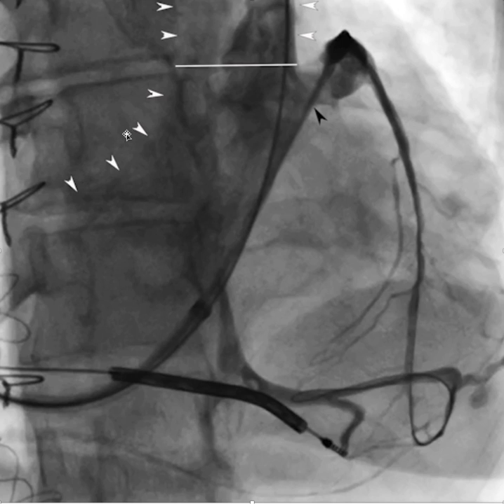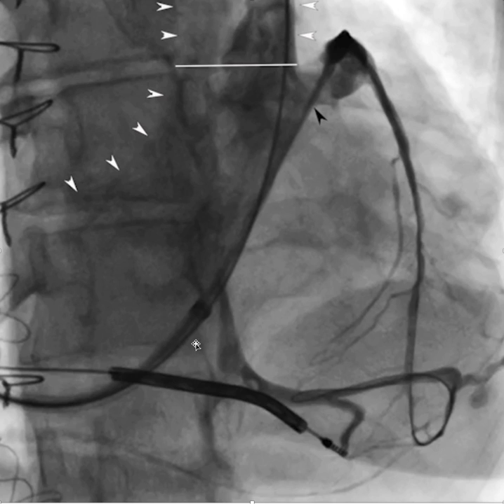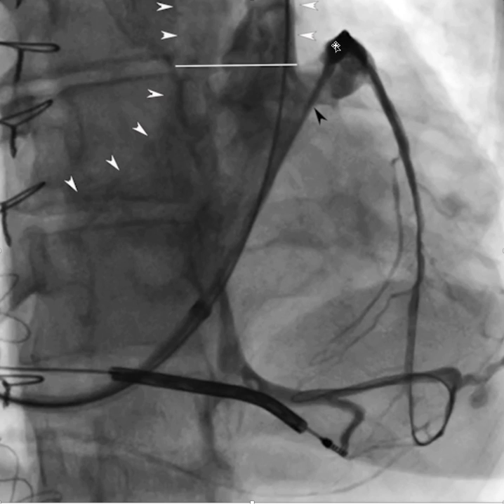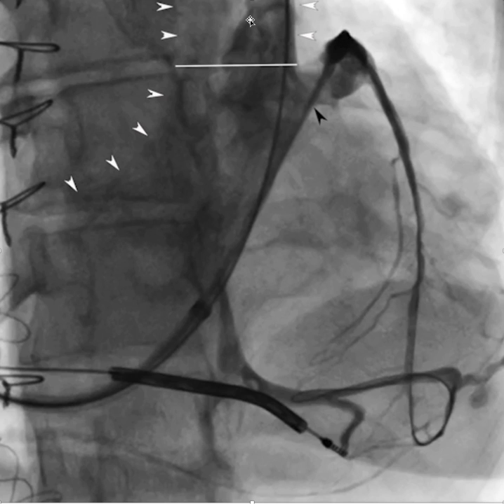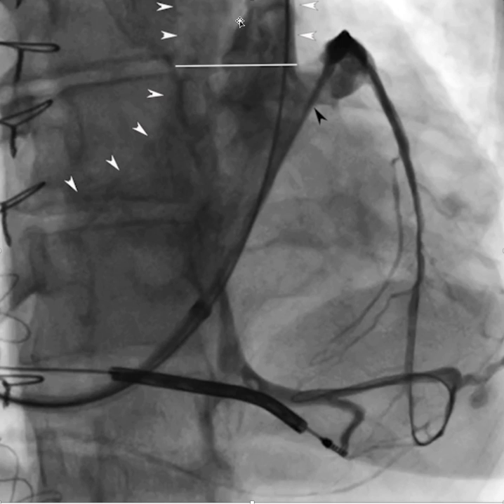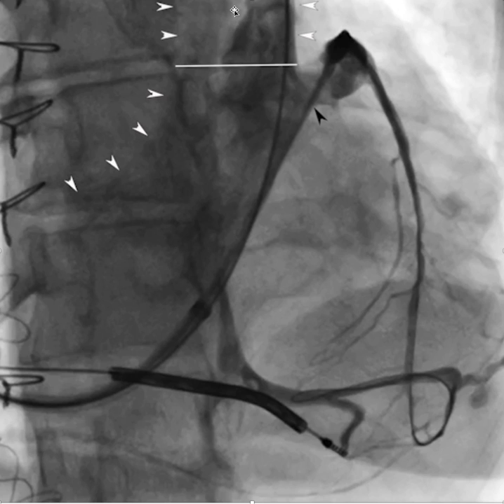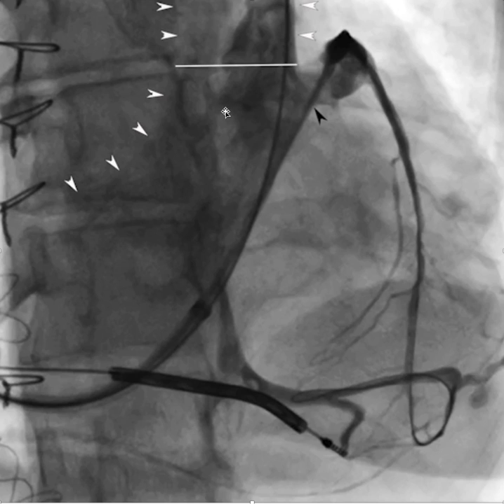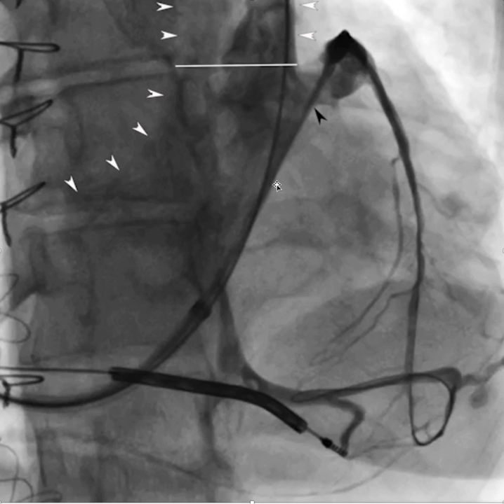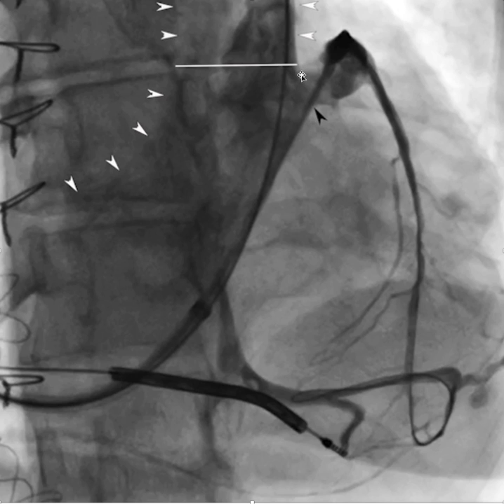Here's the outline of the medial aspect of the coronary sinus and here's the outline of the ventricular side. Above this point is what would be the vein of Marshall if it had involuted. In this case, blood flow from the left side of the body and head is coming down into the coronary sinus and entering at this point. Everything below this entry point is enlarged due to increased blood flow.